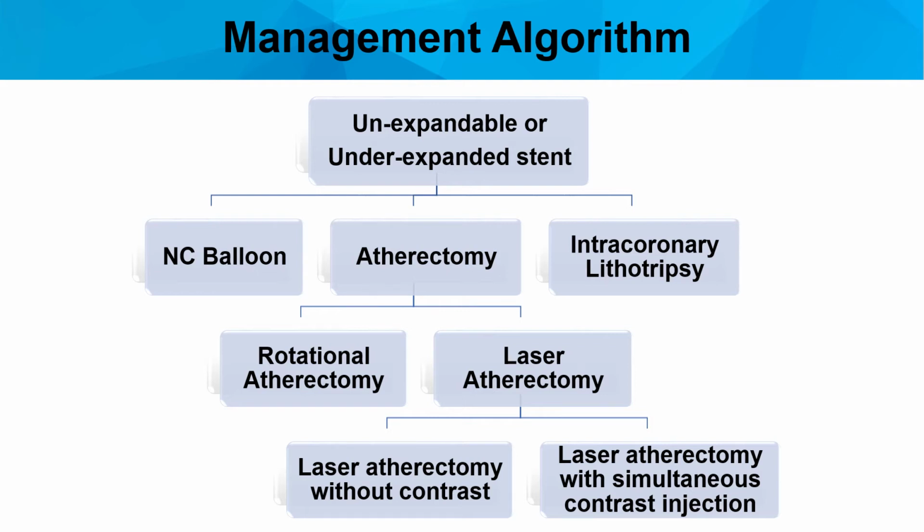You may ask, what about cutting balloons? Can these be used? Now, for cutting balloons or atherectomy balloons, while these cause direct fracture of luminal calcium, ideally these cutting balloons should be used prior to stent implantation, because that provides maximum contact between the cutting balloon and the plaque surface.